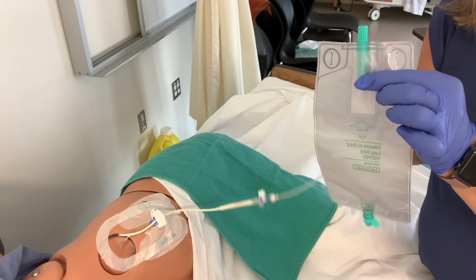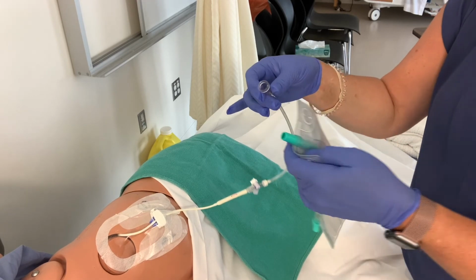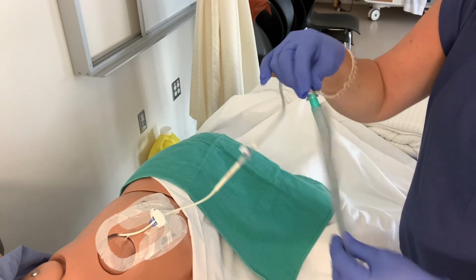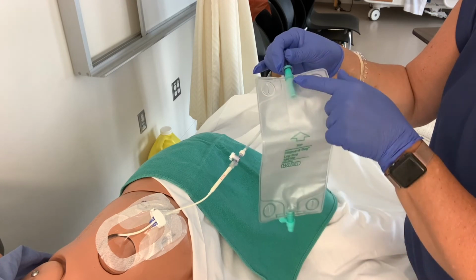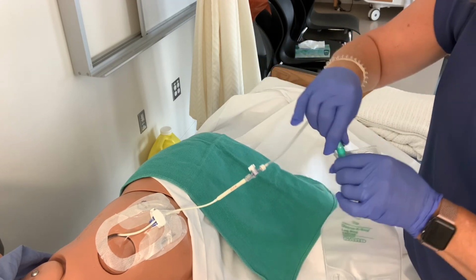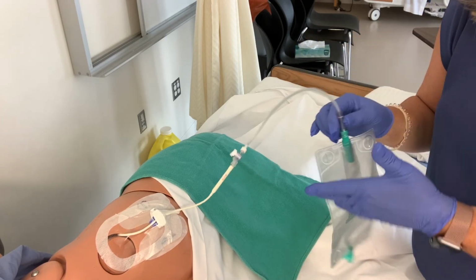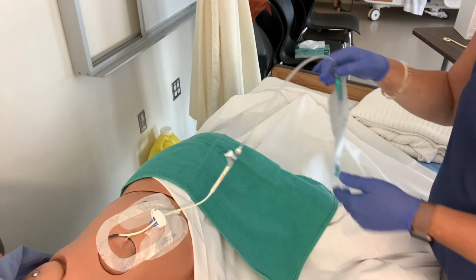The bag looks like so, and the tubing is not connected. So basically when you open it, you're just going to have to add the connecting. It tells you this is the top arrow, and the bottom. It drains from here, and the top is where it's going to connect to the patient. So you would need to assemble this part first, okay? I don't have a second bag to show you, so that's kind of my problem here.